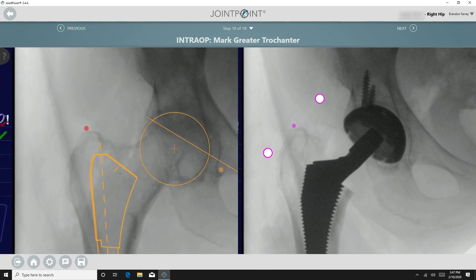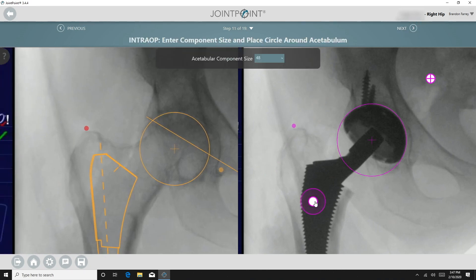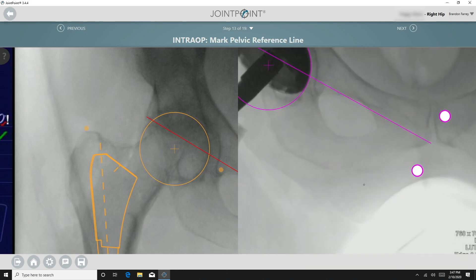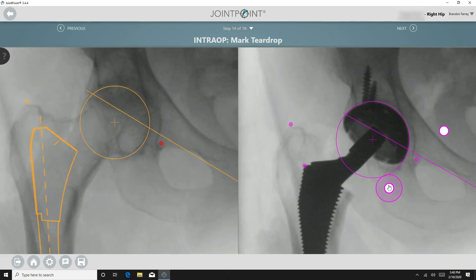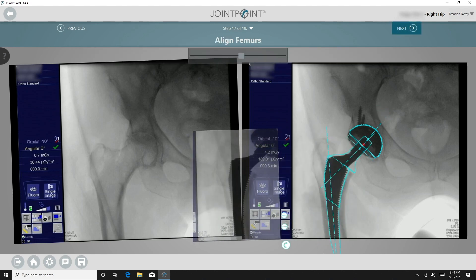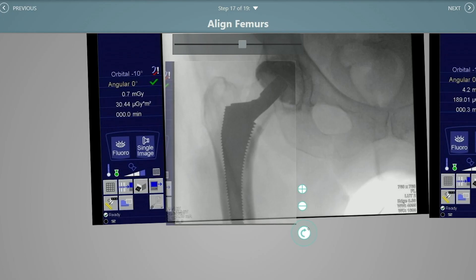You then remark the greater trochanter on the image, enter the component trial sizes, place a circle around the acetabulum, mark the shoulder, mark the pelvic reference line, mark the teardrop, rotate the template to match the cup, and align the femoral template to the canal.